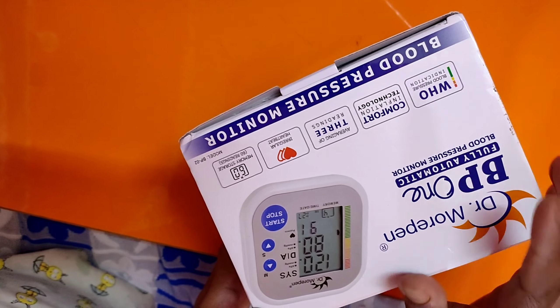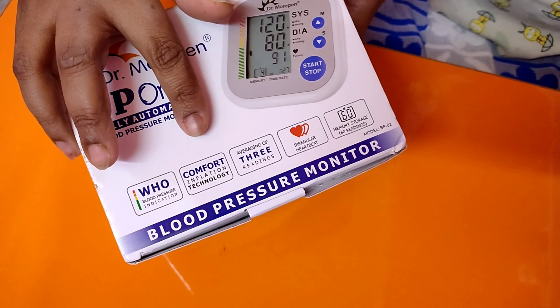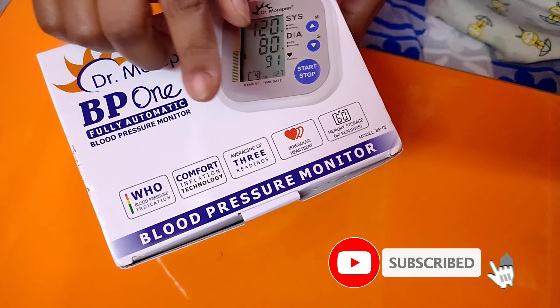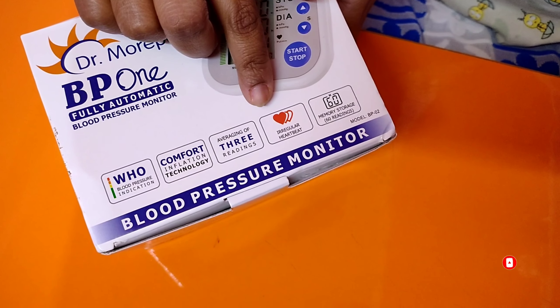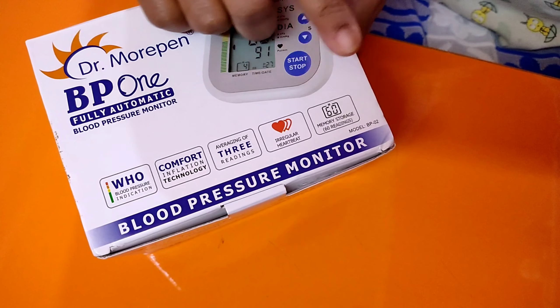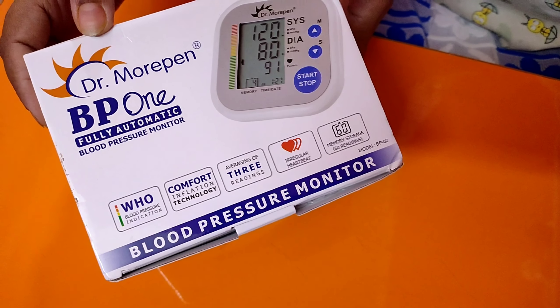A few features of this BP monitor machine are: it has WHO recommended blood pressure indication, it has comfort inflation technology, it gives the average of three readings, it has an irregular heartbeat indicator, and it can store about 60 readings in its memory storage.